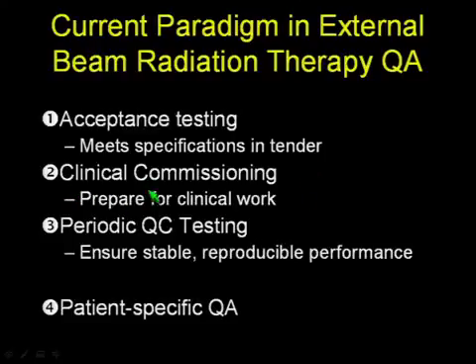The second step is clinical commissioning. So use this system in a lab world where people can test them, can perform dry runs, and assess how this device performs before implementing it into the clinic, and also ensuring that an adequate periodic quality control testing system is implemented to ensure stable, reproducible, and safe performance of these devices. And once all of these three items are dealt with, one can deal with the patient-specific QA that arises for this particular device according to the clinical use that you have back home.